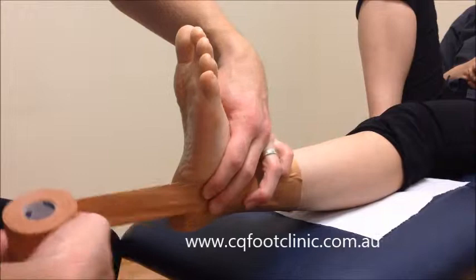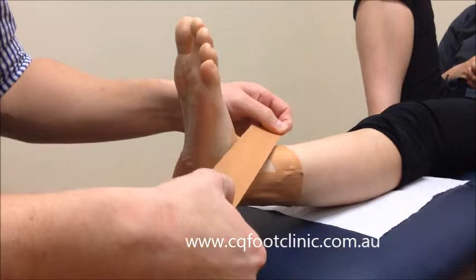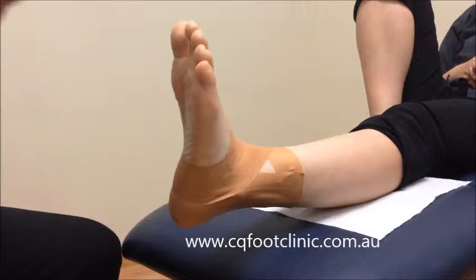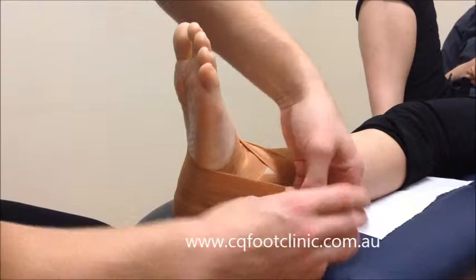Then we start just where the other one finished at the top, come down around the ankle, and back up to the starting point again. We'll do two of those. Then do the same thing on the other side — we start where the other tape finished, put it down and around.